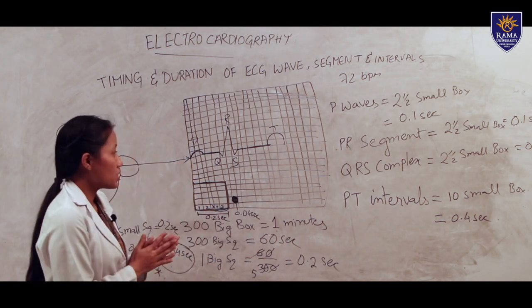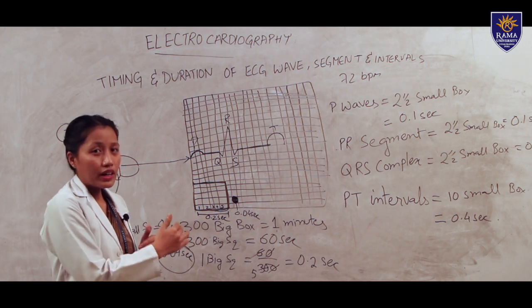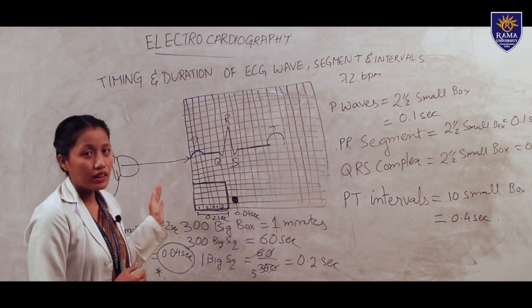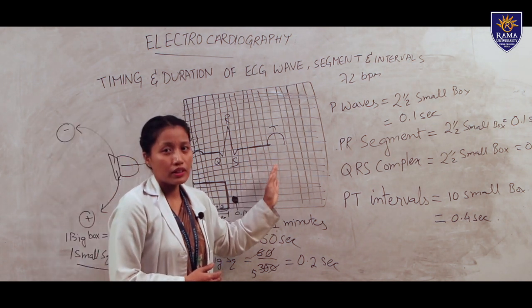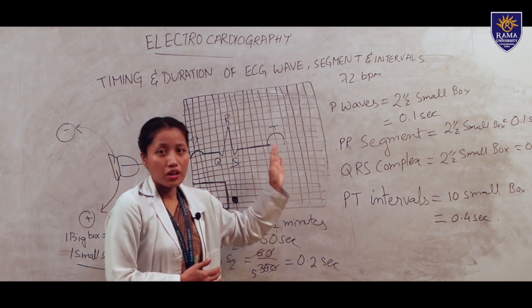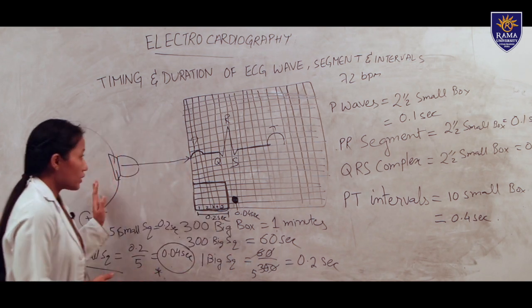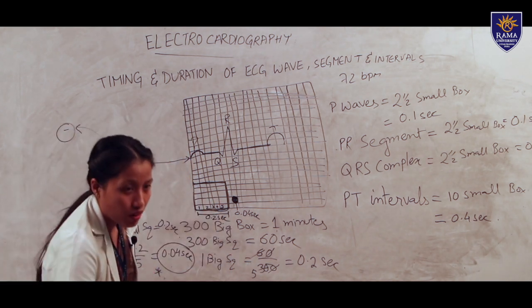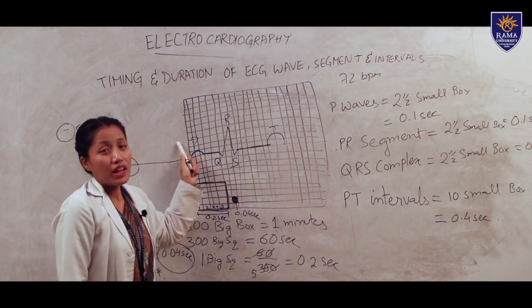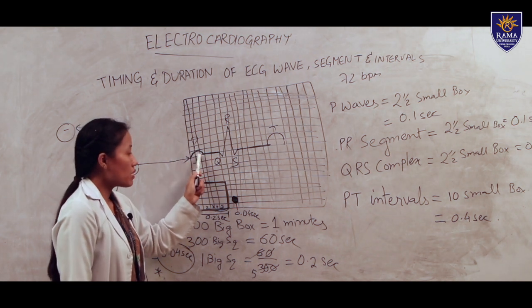After the placement of the ECG, we saw what the electrical activities in the heart are, and these electrical activities of the heart are transformed into a vector. That vector we know as the cardiac vector, and how this cardiac vector produces the ECG pattern we already discussed. In the electrical activity, first the activity starts from the SA node and produces atrial depolarization. The atrial depolarization produces a P wave.